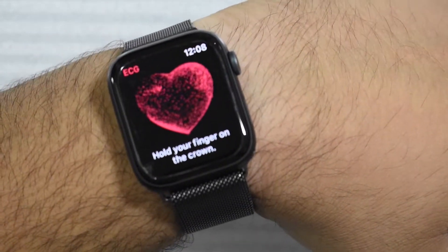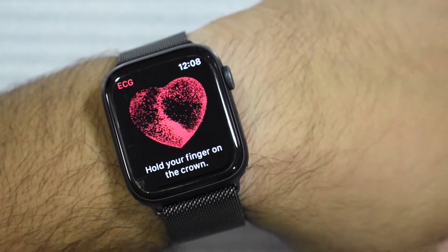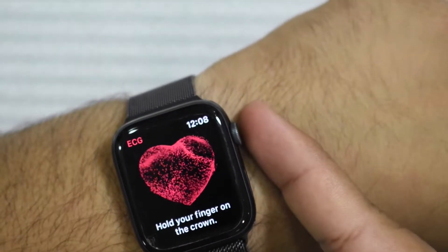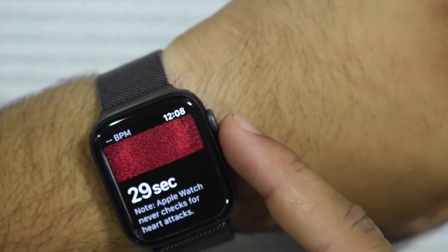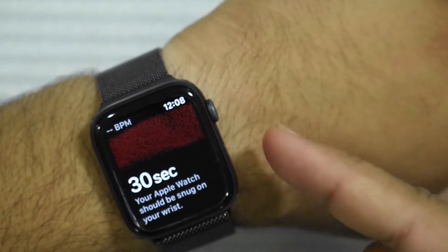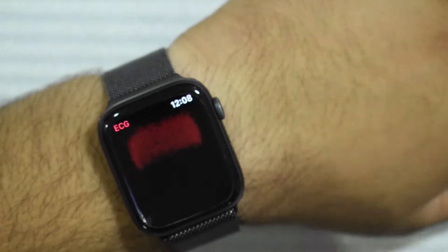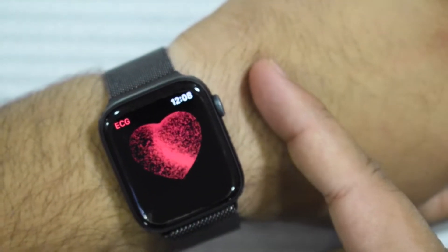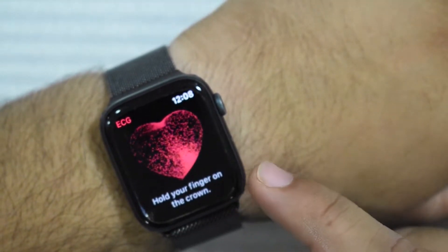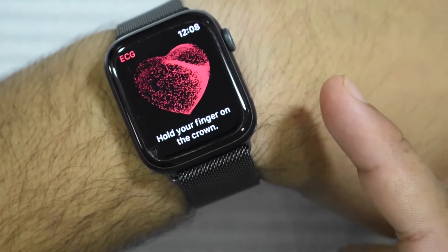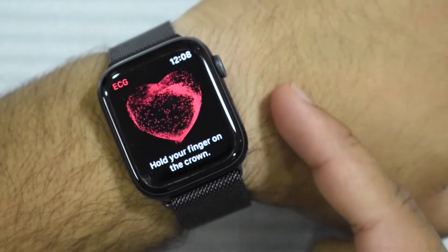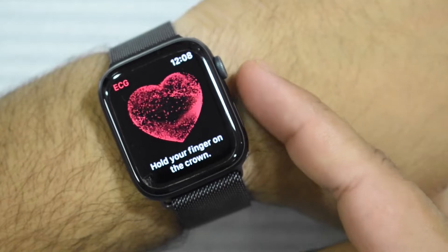I just figured out why I was getting the inconclusive results. The entire crown has to be covered by your finger. I had to press down on my skin here to get in contact with the entire sensor. So if you guys are having inconclusive results, try that — make sure your entire finger is on the sensor.